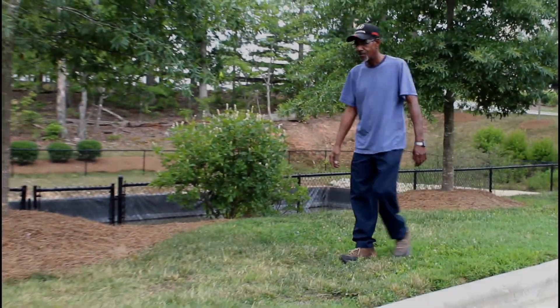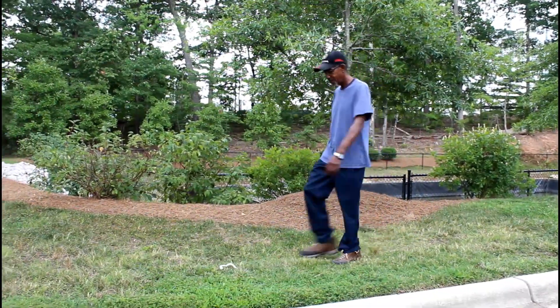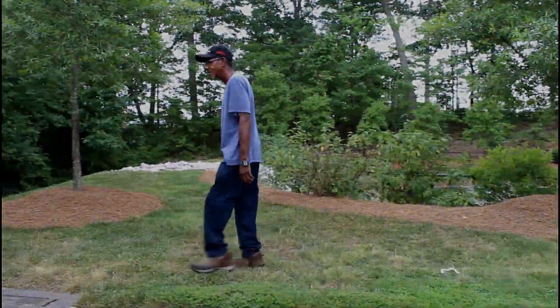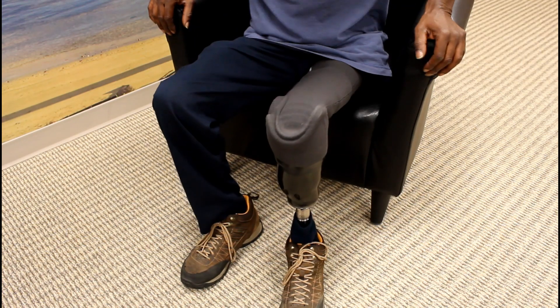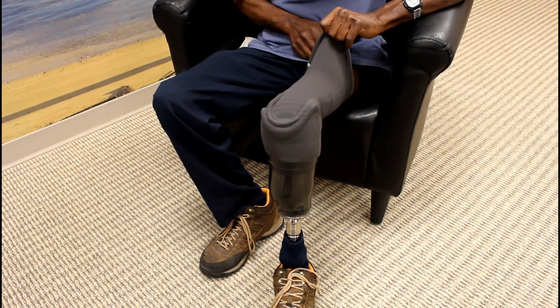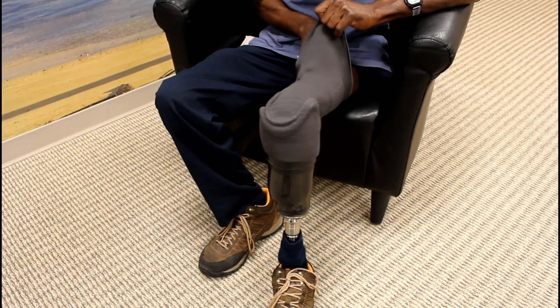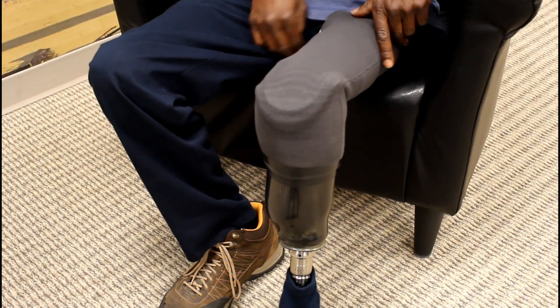We have discussed the importance of an airtight system so that suction can be maintained. The easiest way to check that the system is working properly is to don your socket and walk around for a few minutes. When you sit down, you will notice that the suspension sleeve is snugly molded around your knee and socket. This is a sign air has been pulled from the system and suction is occurring.